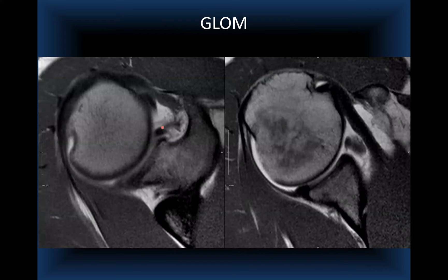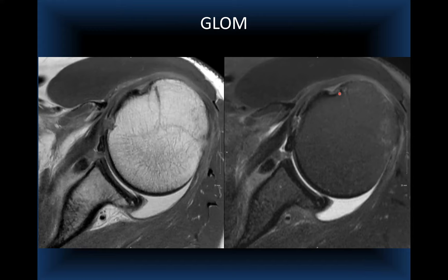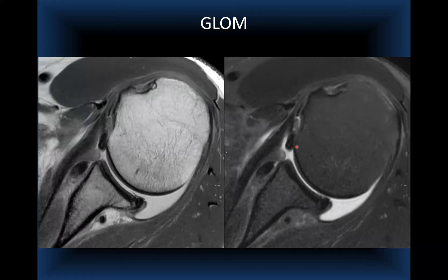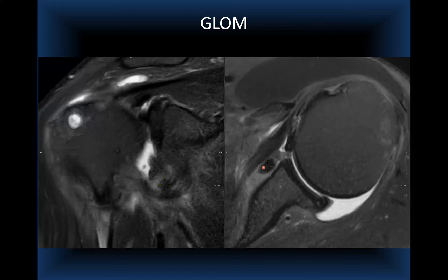Another GLOM case with a Hill-Sachs lesion shows the anterior labrum displaced and appearing as an ovoid mass. In a case with two apparent ovoid masses, since you cannot have two GLOMs, I check the bicipital groove — which is empty — confirming one mass is an intra-articular dislocated long head biceps tendon, while the other corresponds to the torn anteroinferior capsulolabral complex.